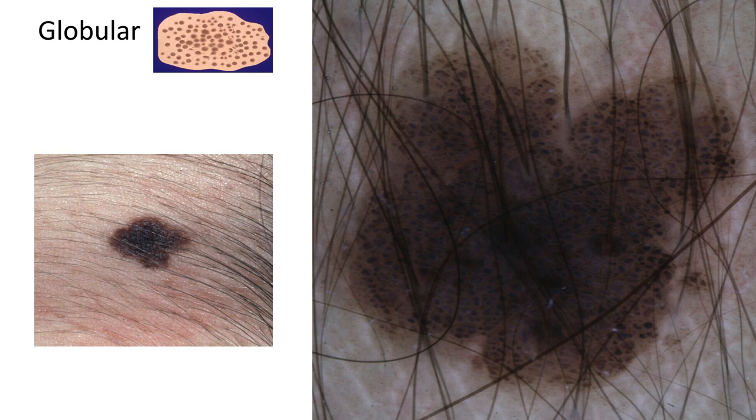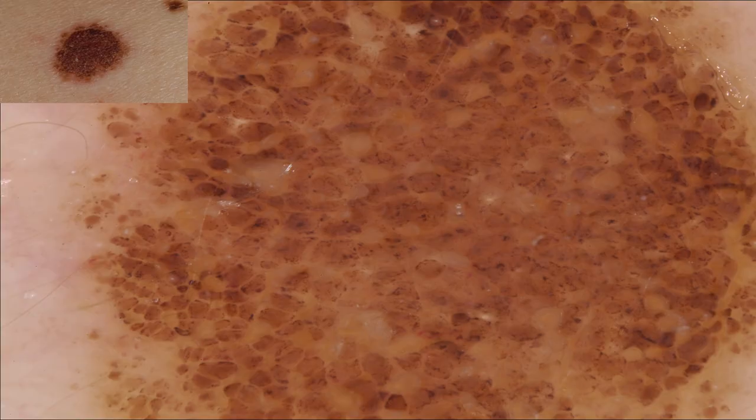The second pattern is the globular pattern, characterized by brown, blue, or black rounded structures known as globules. Here we have a beautiful example of a globular pattern throughout the lesion. Another example shows brown round structures — globules — with larger bluish globules present as well. Sometimes those globules can have an angulated appearance; this is known as a cobblestone appearance. Cobblestone globules are also suggestive of a congenital origin.